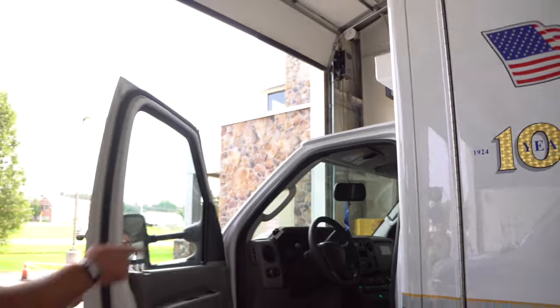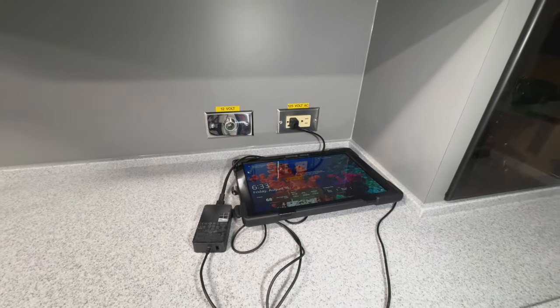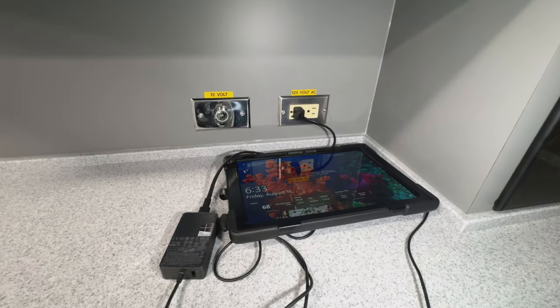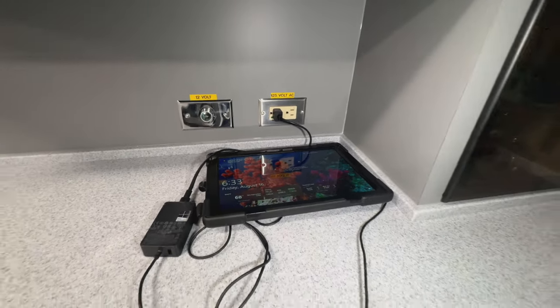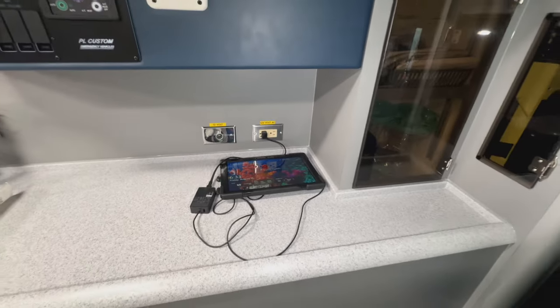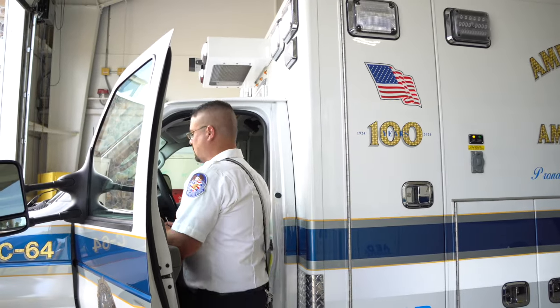We're dispatched through the radio system, and there's a tablet in the back of the unit that the call will pop up on. It stays in the back for charging because they use it for checkout purposes, PCRs with patients, and report documenting. We also get the notification through our phones — it gives us the CAD information as we're heading to the call. That gets rid of the laptops by using tablets and phones.